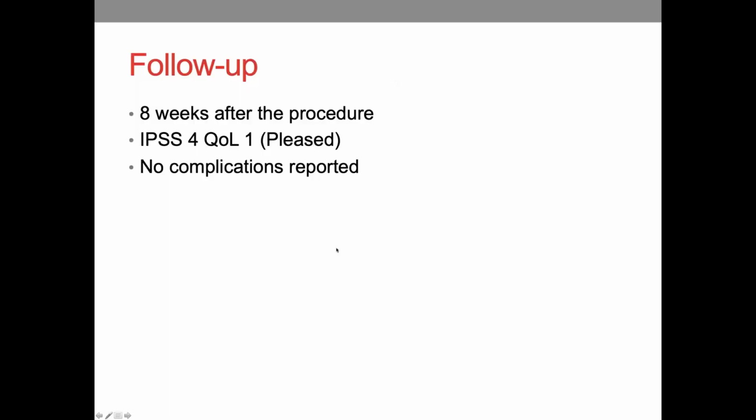All right, so after 8 weeks of that procedure, his IPSS was excellent at that time, 4, that's really good. Went down from 20, I think it was 25 in the first slide.